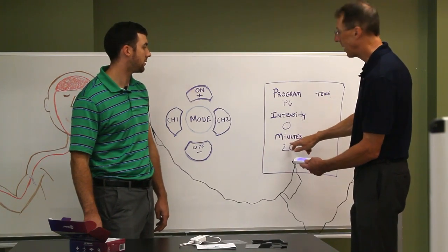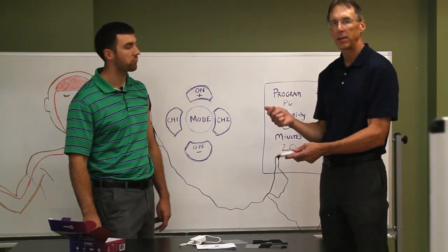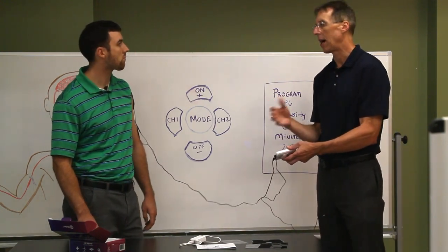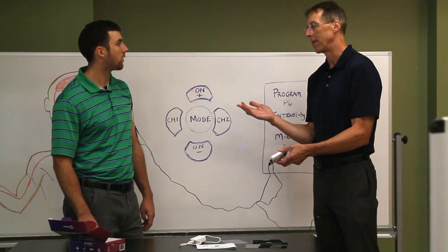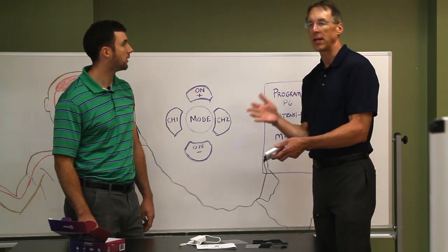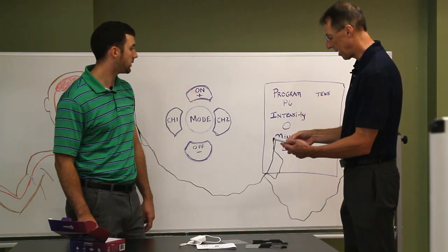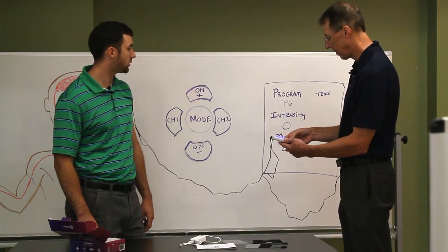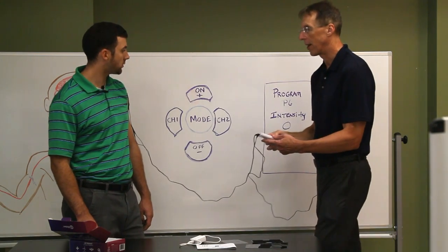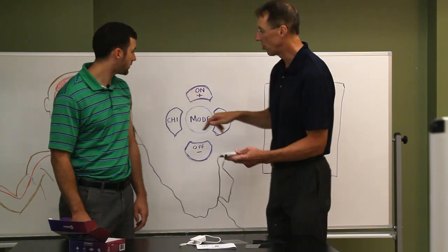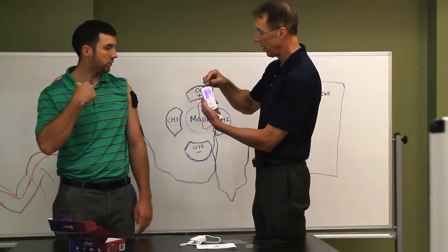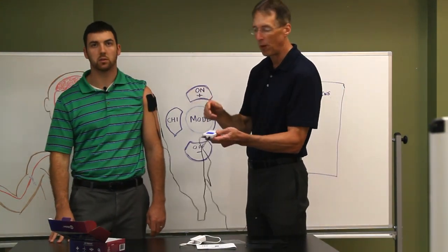Then I hit mode again and it's going to go down to the minutes. They recommend not really going above the 60. I was taught you could have it on all day. So I think you can go 60 minutes, then maybe give yourself a break and then put it on again. So I hit mode again, it locks into the 60. And now we're ready to go ahead and start here. So now I'm going to hit channel two because there's two channels. That's me, channel two, and he's on channel two, and I'm on channel one.